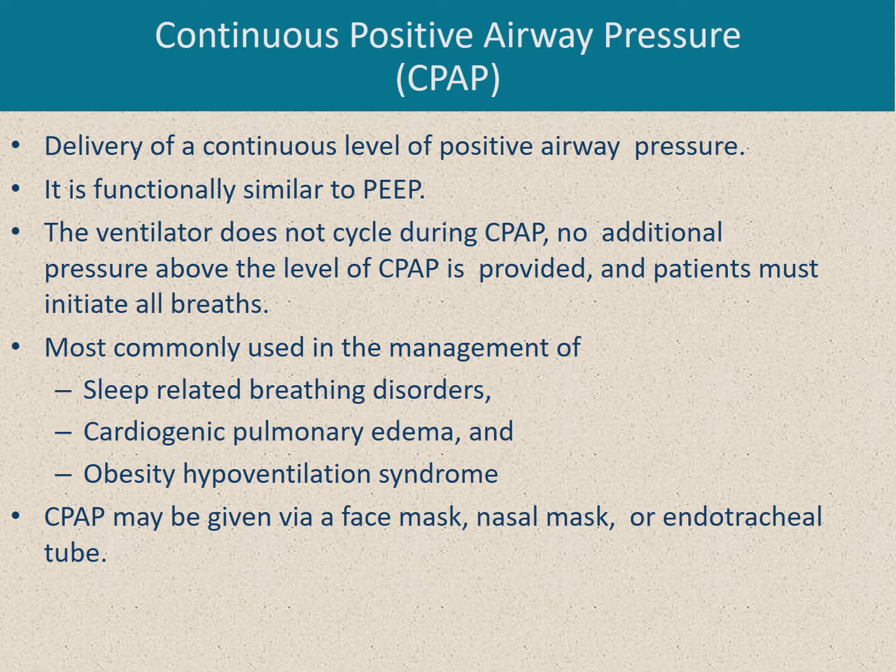It is most commonly used in the management of sleep-related disorders, and it is of great help during pulmonary edema, like PEEP, and also in obesity hypoventilation syndrome.